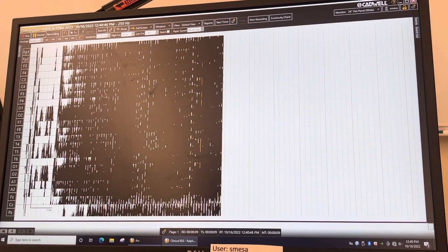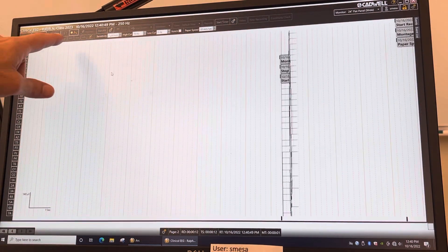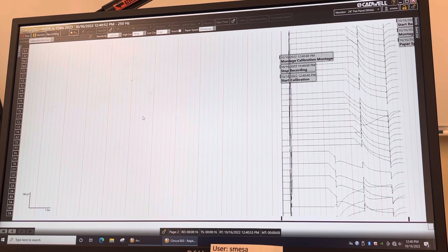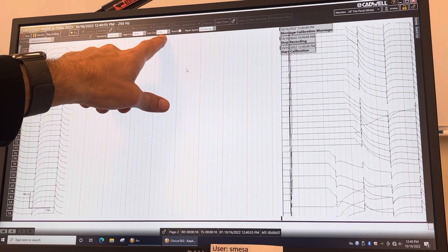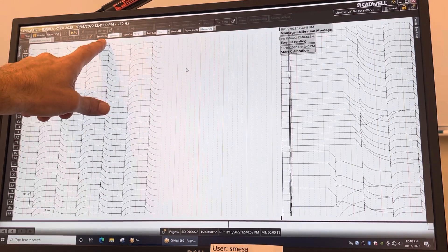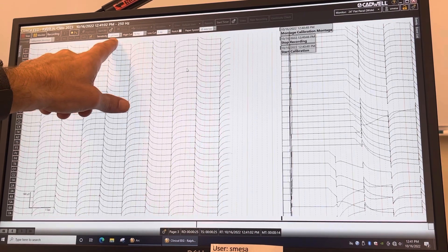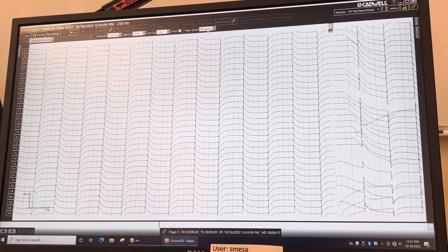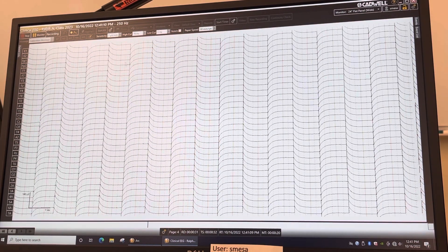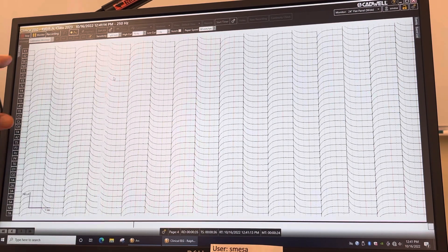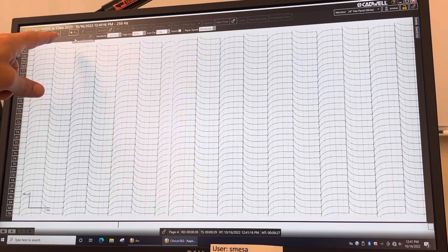Click 'Start' and you'll see the data start scrolling across — this is just garbage at first. Put it on calibration, then make sure the low cut filter is at 1, the high cut is at 70, the sensitivity is at 7 microvolts per millimeter, the notch is off, and the paper speed is 30 millimeters per second.